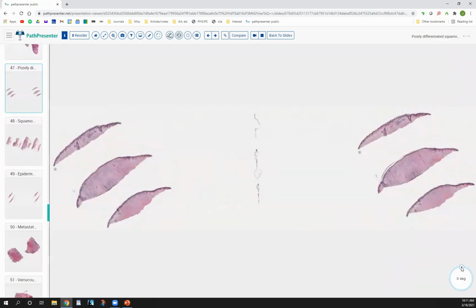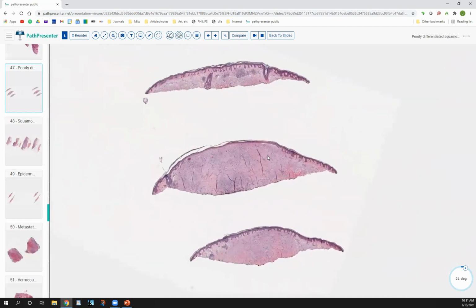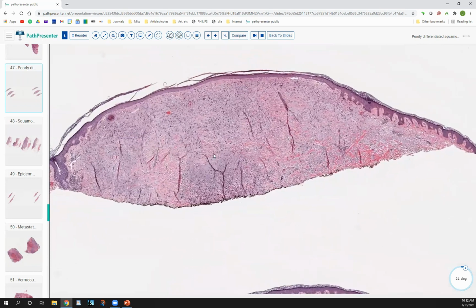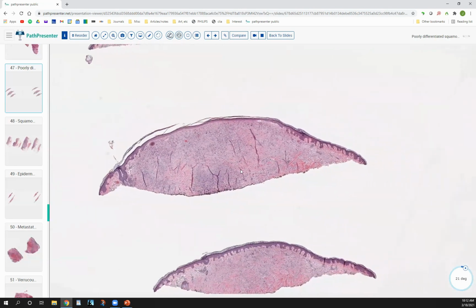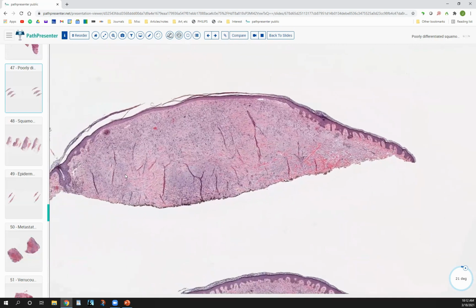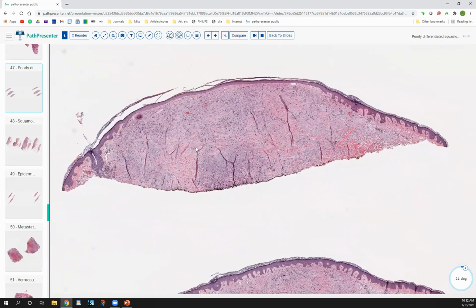Okay, as I said earlier, squamous cell carcinoma can get pretty poorly differentiated and almost impossible to recognize, which is what we're seeing right here, actually. If I had this biopsy, it's a shave biopsy, probably from sun-exposed areas, some solar damage there, probably an older patient, I would really start going down my atypical fibroxanthoma or AFX differential diagnosis.